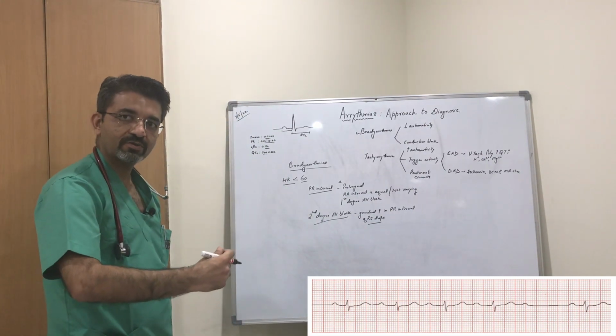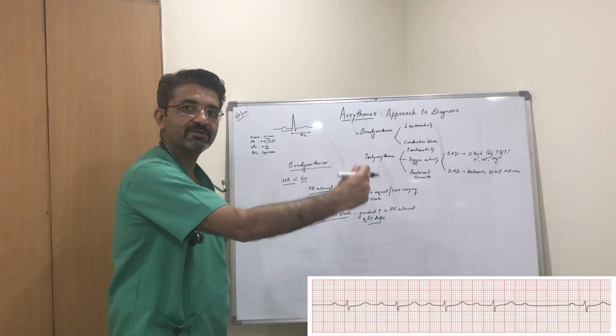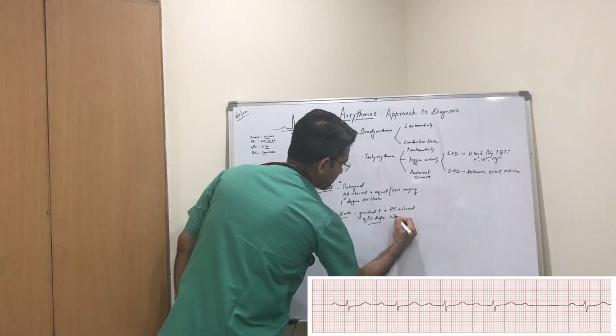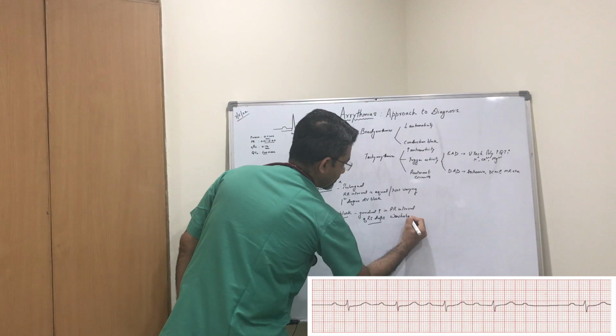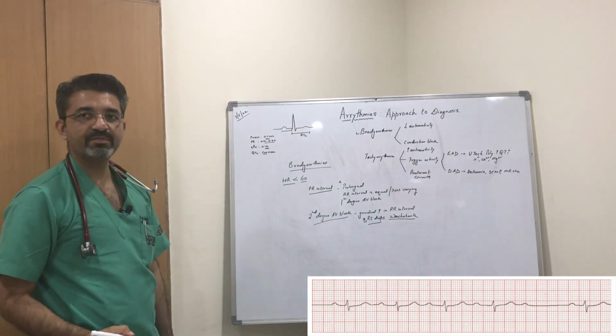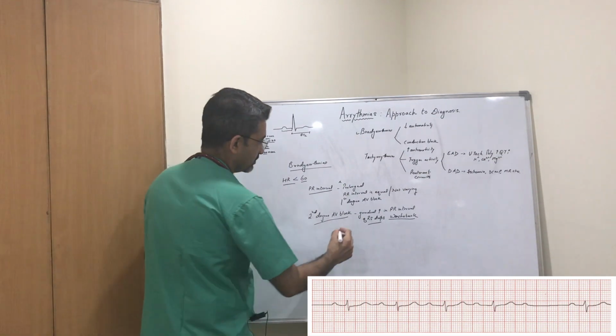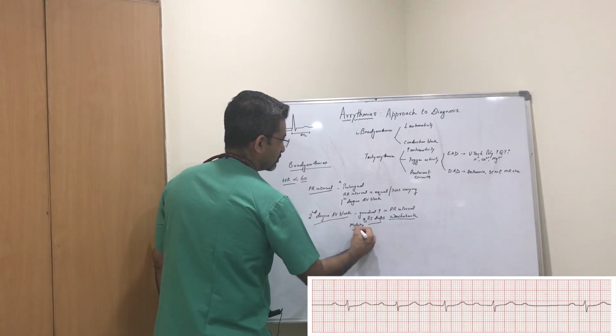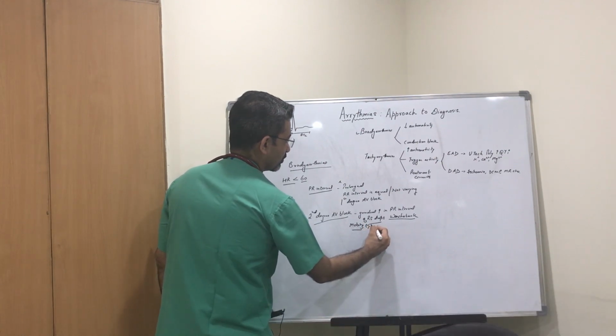This is known as the Wenckebach phenomenon. Right? This is Mobitz type 1.